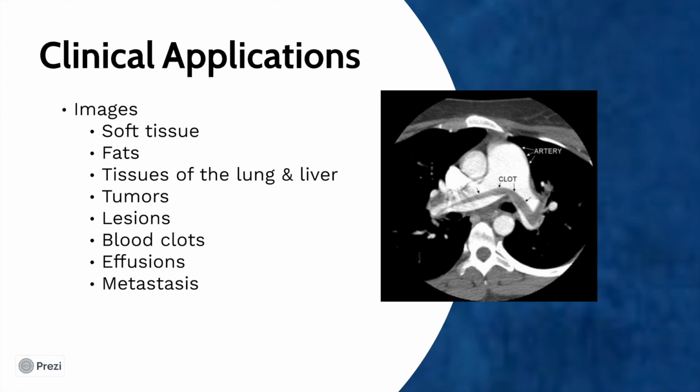The clinical applications in the images can show soft tissues, fats, tissue of the lung and liver, tumors, lesions, blood clots, effusions, and metastasis.